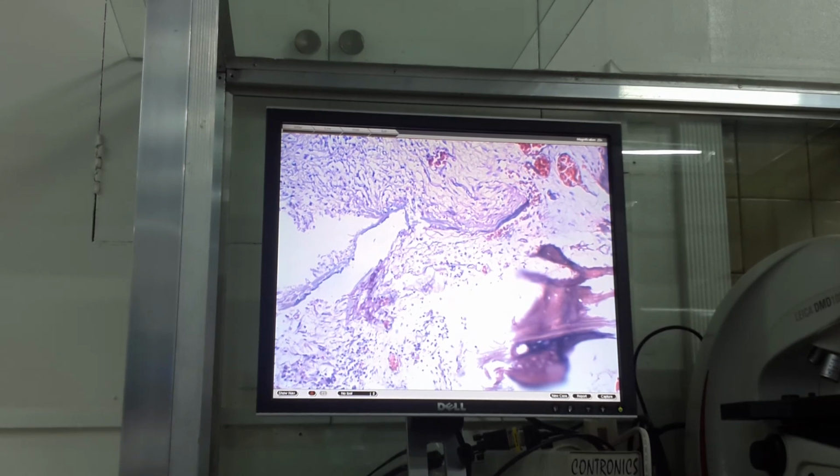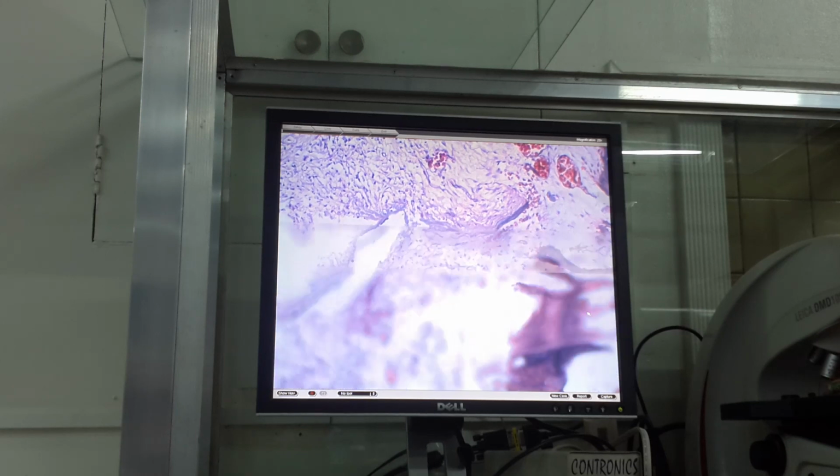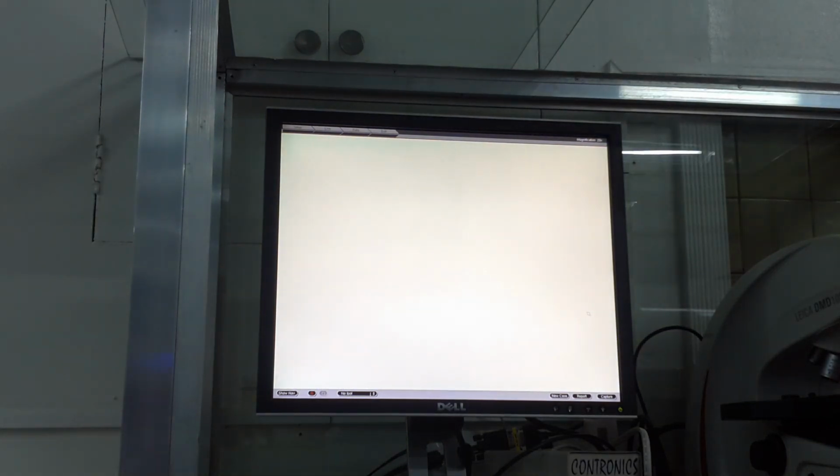So what do you have here? You have a chronic inflammatory response. Okay, this is granulation tissue and these are chronic infiltrates. This is chronic osteomyelitis. Okay, that is the last slide. So we have just reviewed 1, 2, 3, 4, 5, 6, 7, 8, 9 slides with 8 cases because there are 2 slides with leiomyomas. Can I have your attendance sheet?